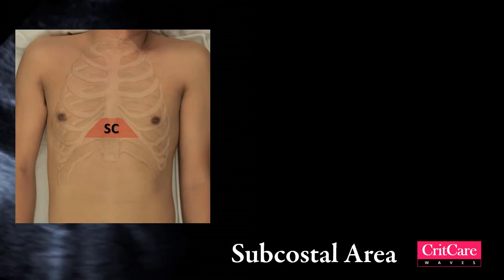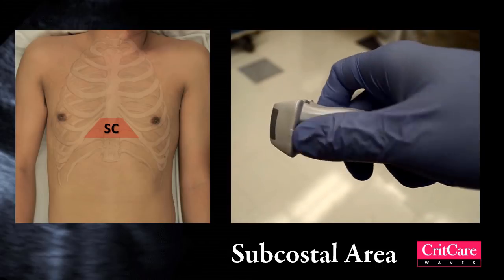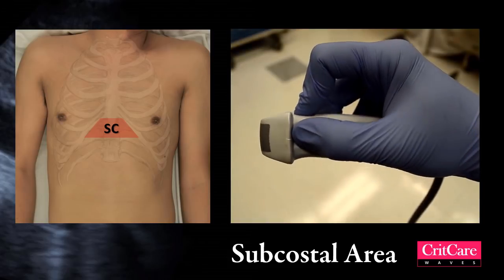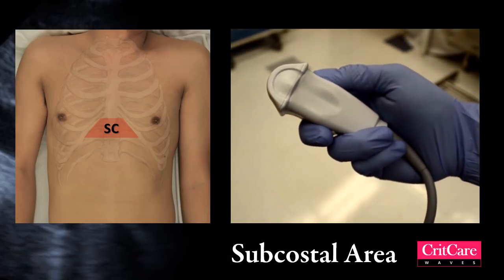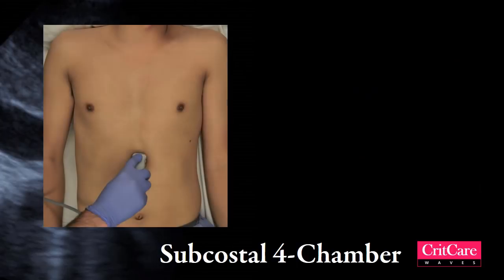To obtain the subcostal 4-chamber view, holding the probe in a different configuration improves image acquisition. Hold the probe so that your hand is mounted on the probe. The tail of the probe will be in your palm as shown. Use your index finger to stabilize the tip of the probe. Place the probe in the subcostal area with the marker oriented towards the left, or 3 o'clock.